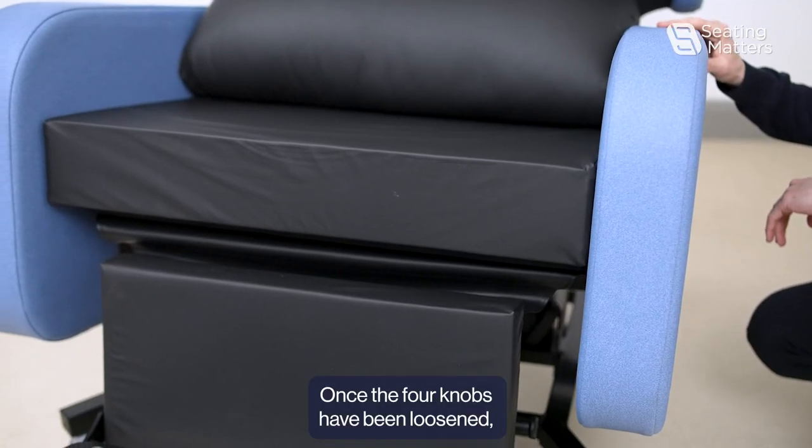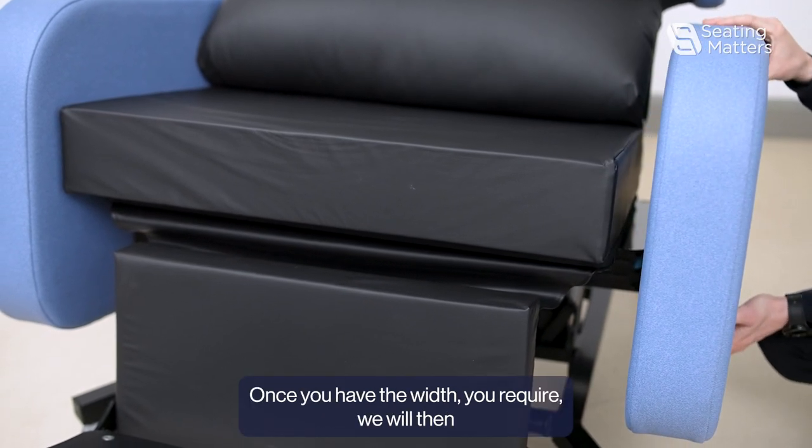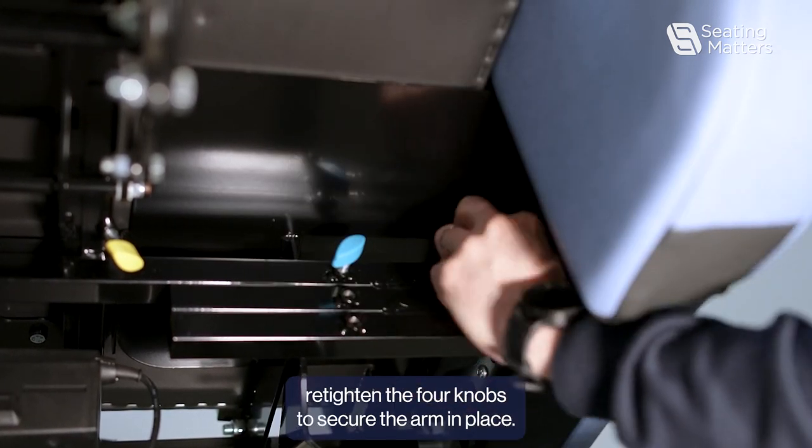Once the four knobs have been loosened, the arm can slide out to the desired width. Once you have the width you require, re-tighten the four knobs to secure the arm in place.